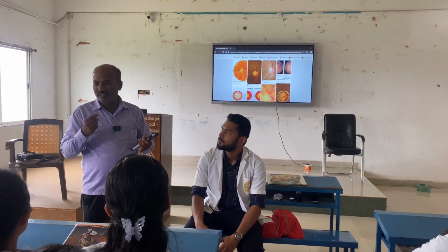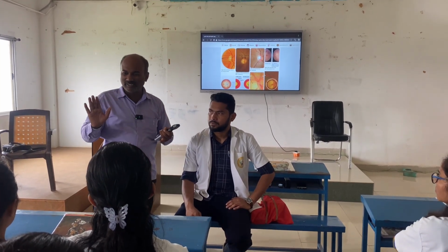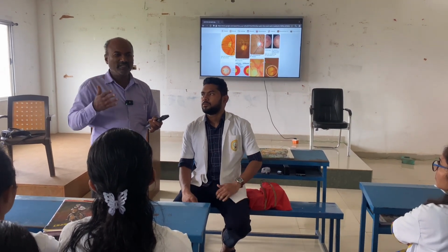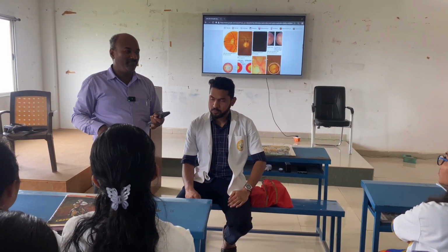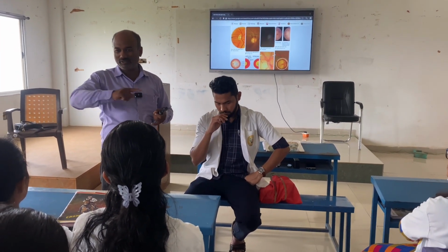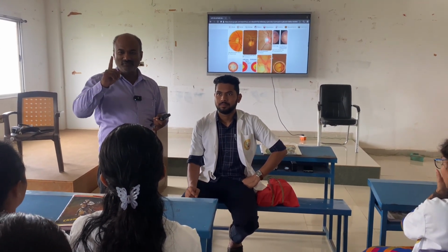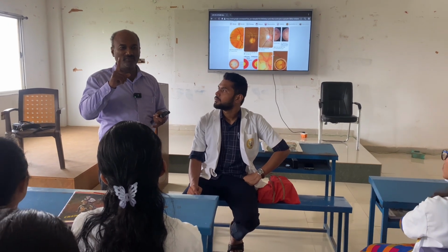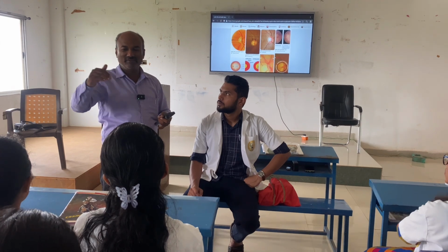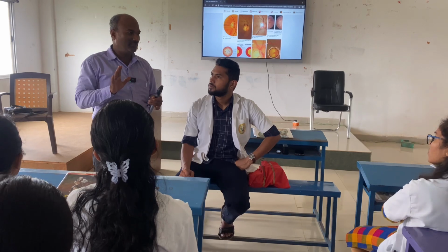ठीक है. कॉर्निया, उसमें भी ब्लड वेसल्स नहीं है. 2 millimeter of the limbus has the blood supply, but the rest of the cornea doesn't have, right? लेंस में भी नहीं है. विट्रियस में इंट्राएम्ब्रियोनिक लाइफ में एक रहता है, पैदा होने के बाद वो बंद हो जाता है, हाइलोइड कैनाल बोलते हैं उसको बाद में. ठीक है, वो रहता है. In 15 years of my career, I have seen only one case of persistent hyaloid canal with the blood in the vitreous cavity which has not entered the vitreous. It was still in position.